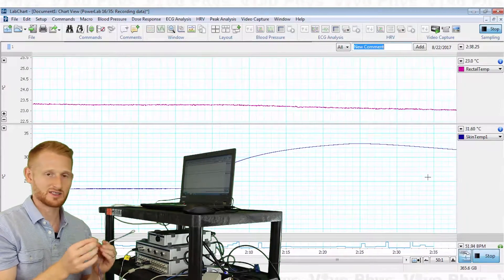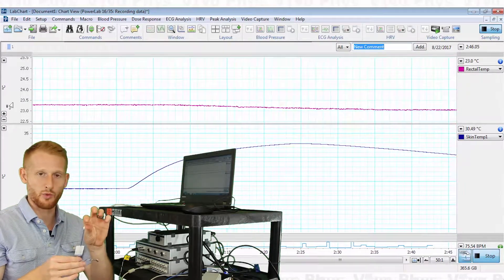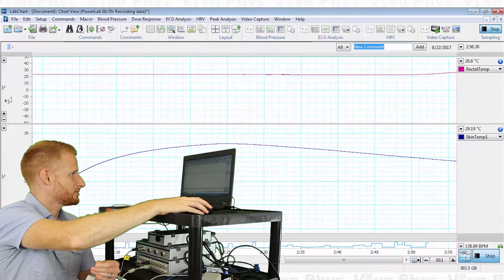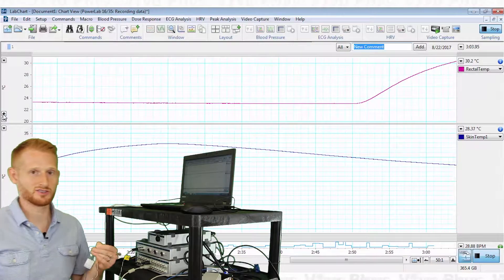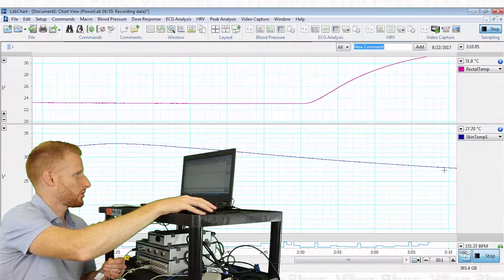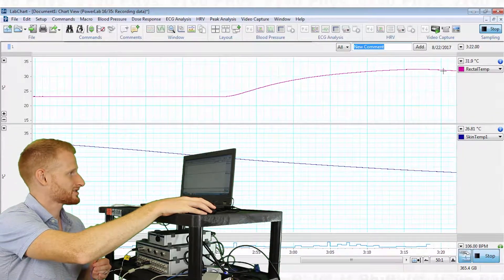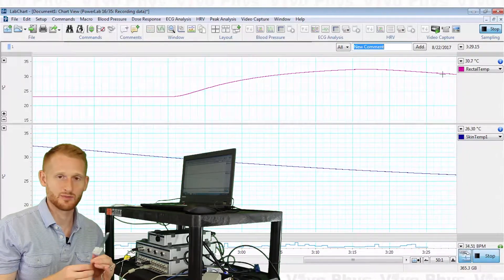Now let's do the same with the rectal temperature probe. Looking at the top channel, if I grab the tip — the white part where it senses temperature — you'll see its temperature start to rise as well, going up really fast. After auto-scaling you can see it climbing, just like the skin probe did. Meanwhile, looking back at the skin temperature probe, it's clearly come down quite a bit since I let go. When I release the rectal probe tip, its temperature slowly starts coming back down as it loses heat to the surrounding environment.